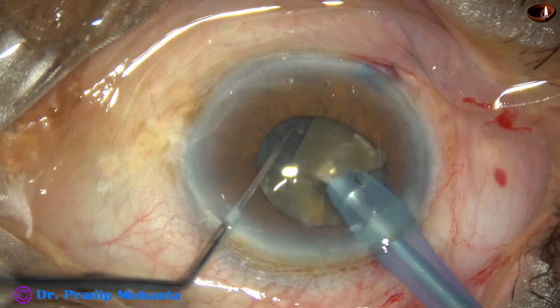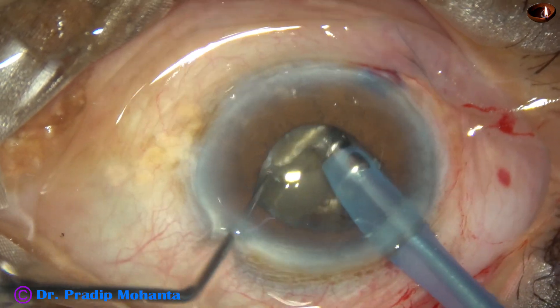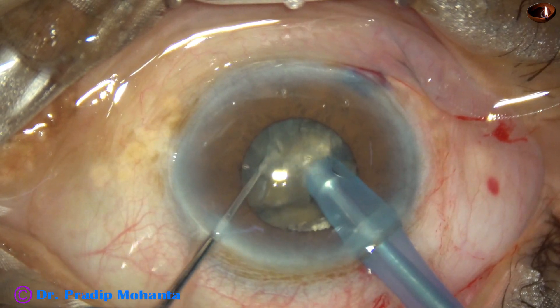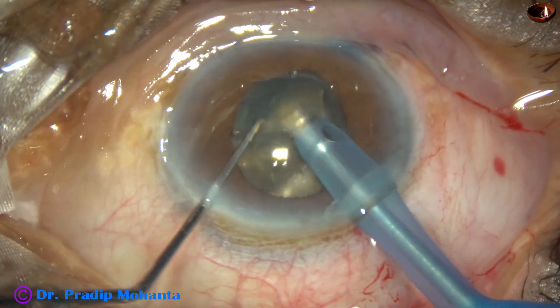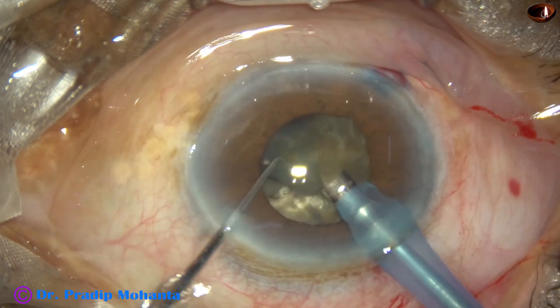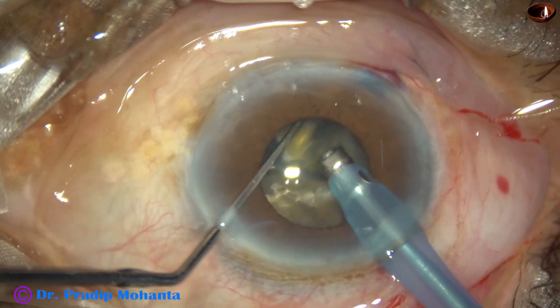This cataract is hard but not very hard — nucleus sclerosis is about grade 4. If it is a hard and black cataract, we should not take this chance of doing it without a pupil expansion device. In those very hard nuclei, we should use a pupil expansion device. We should have visibility of a larger area and then do the surgery. This is my personal view.